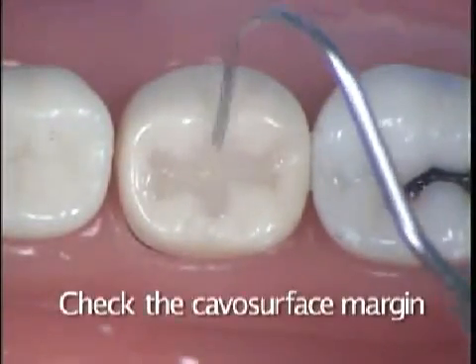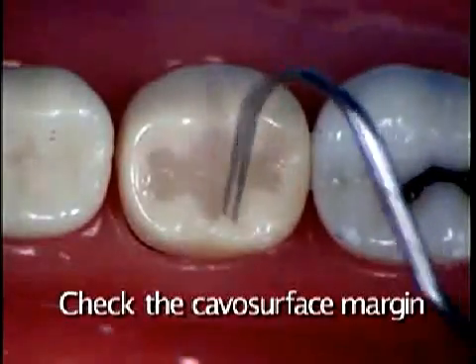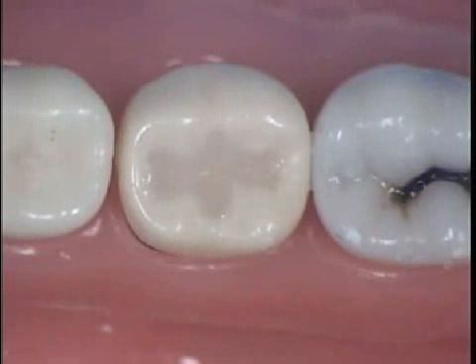The next step is to check for any excess or sub-marginations that you may have. At this stage, you may add more composite if needed because you still have the oxygen-inhibited layer.